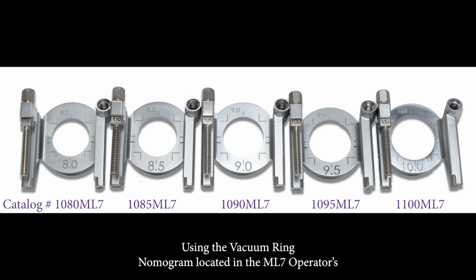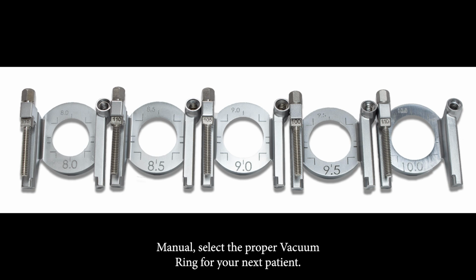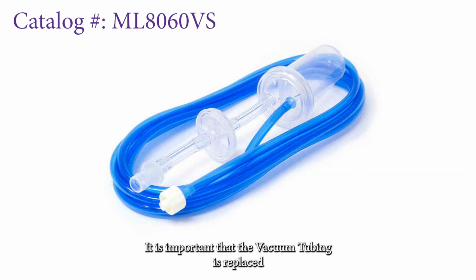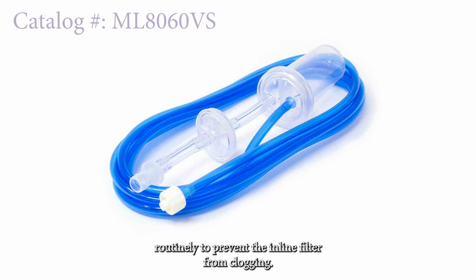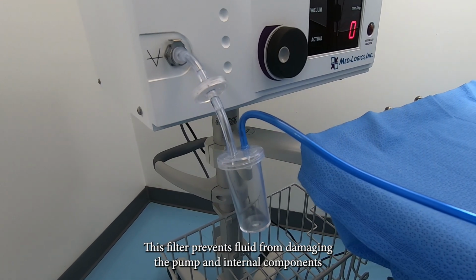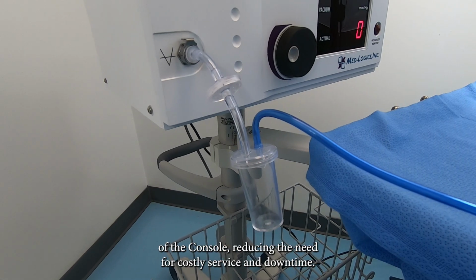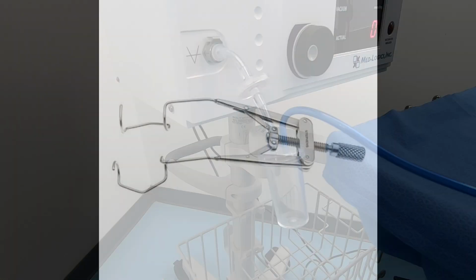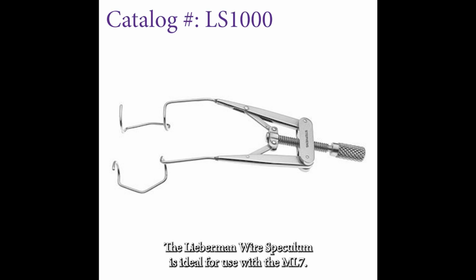Using the vacuum ring nomogram located in the ML7 operator's manual, select the proper vacuum ring for your next patient. It is important that the vacuum tubing is replaced routinely to prevent the inline filter from clogging. This filter prevents fluid from damaging the pump and internal components of the console, reducing the need for costly service and downtime. The Lieberman wire speculum is ideal for use with the ML7.